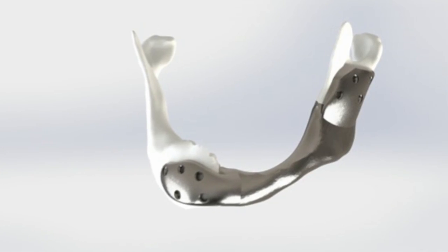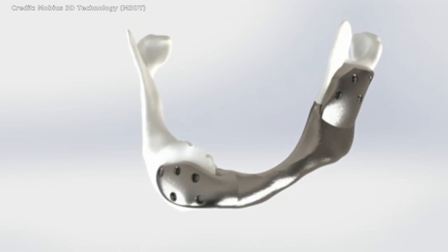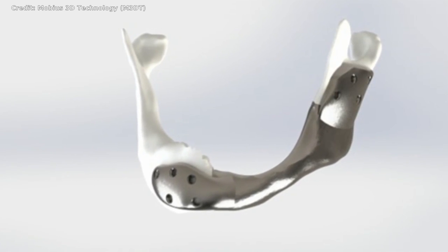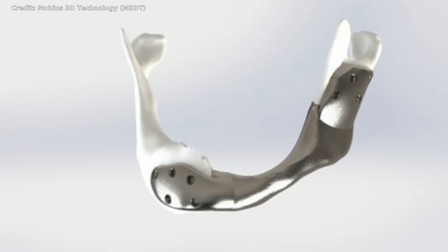After four years of intensive research by the Netherlands Cancer Institute and the Dutch Mobius 3D technology, a titanium lower jaw was implanted for the first time in a head and neck cancer patient.